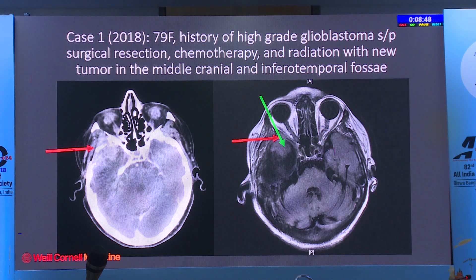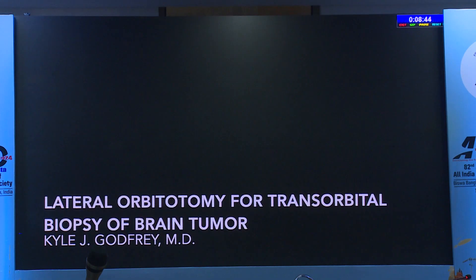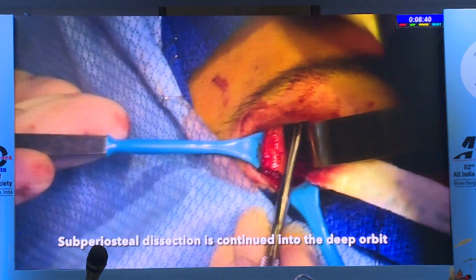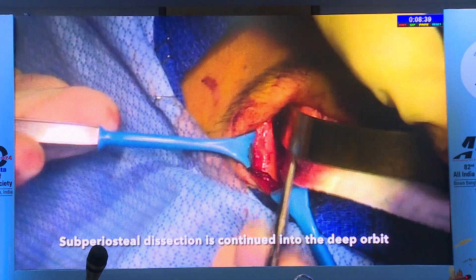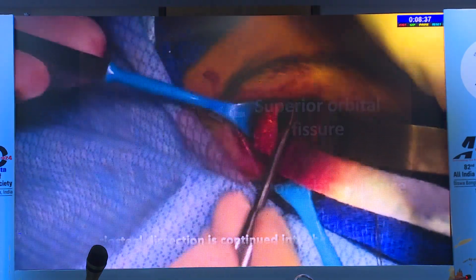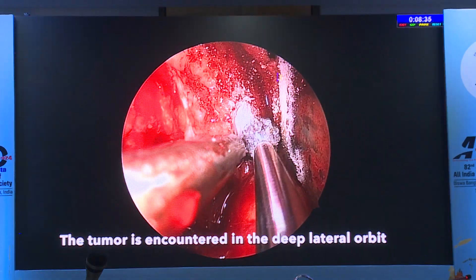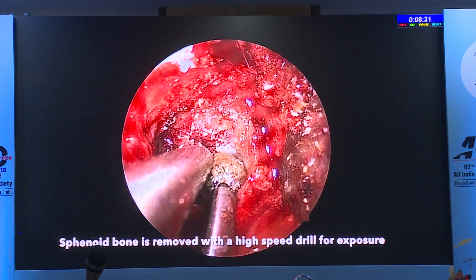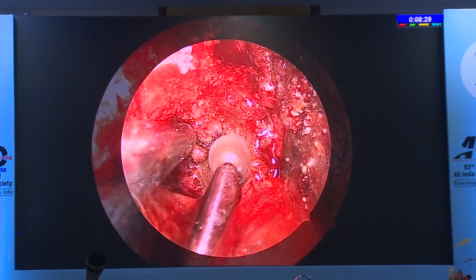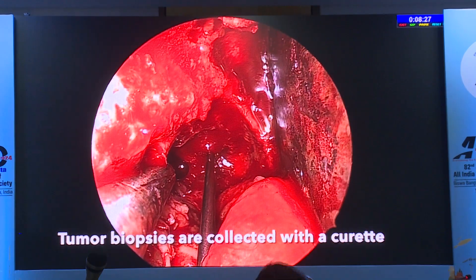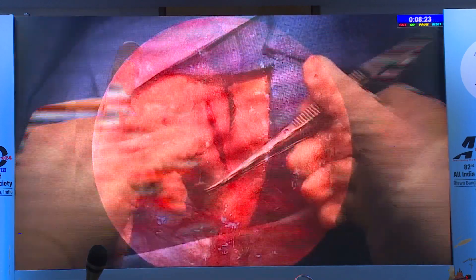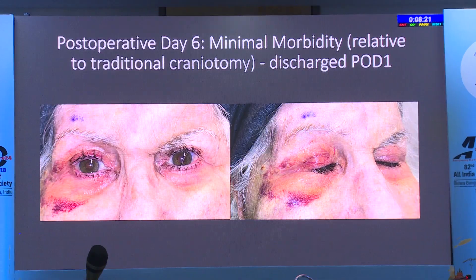The pathology was in the middle cranial fossa extending into the lateral orbit—readily accessible without a lot of deep dissection. Using the endoscope, bone is removed in the greater wing of the sphenoid and a biopsy can be collected. A pretty straightforward case allowing a diagnostic biopsy while avoiding a craniotomy, with standard closure.